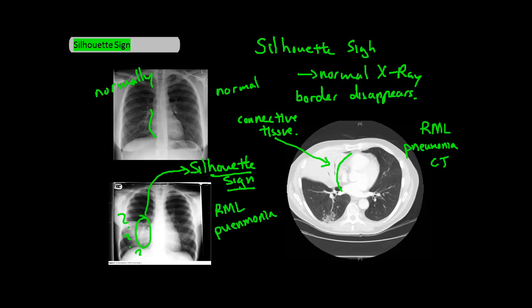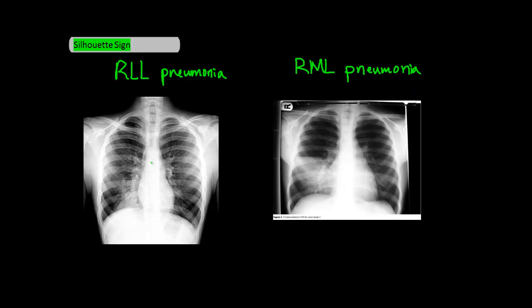Now for fun, let's take a look at a right lower lobe pneumonia in comparison to the right middle lobe pneumonia we just looked at. They're about in the same position, but notice that the right heart border is still visible with the right lower lobe pneumonia, but disappears with the right middle lobe pneumonia — the silhouette sign. If you understand the silhouette sign, you should know why: it's the right middle lobe that's in contact with the right heart border, not the right lower lobe.